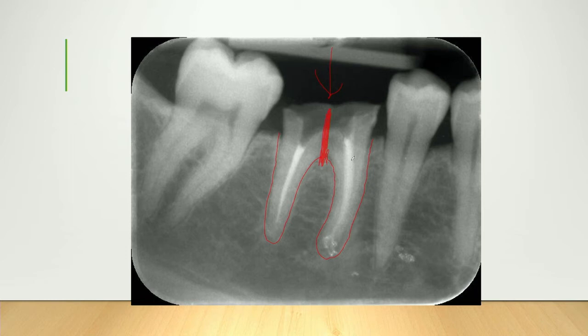So we've got a question from Paul Birch. What sort of burr is the best for bone removal? I use a straight handpiece. So in my straight handpiece, I've got a burr that is tungsten carbide, and it has this kind of shape here, okay? It's about, from memory, about 1 centimetre, maybe 1.5 centimetre long. So that is the best burr to go around retained roots.